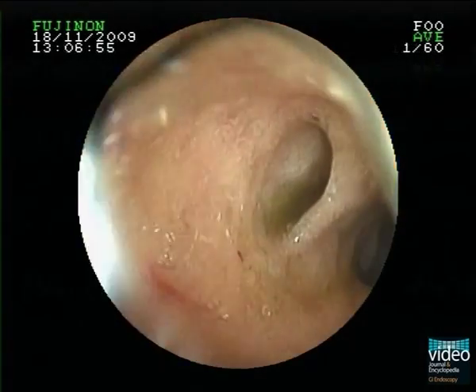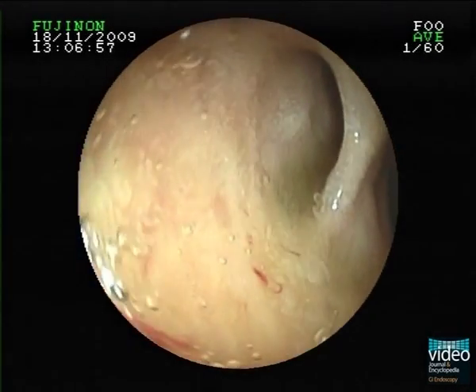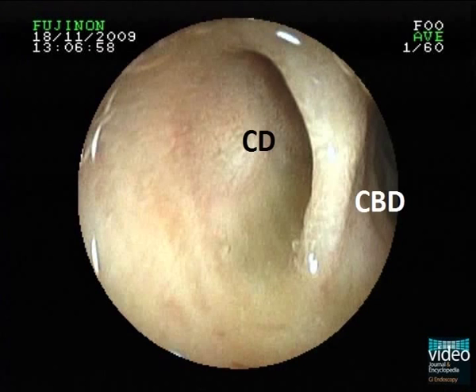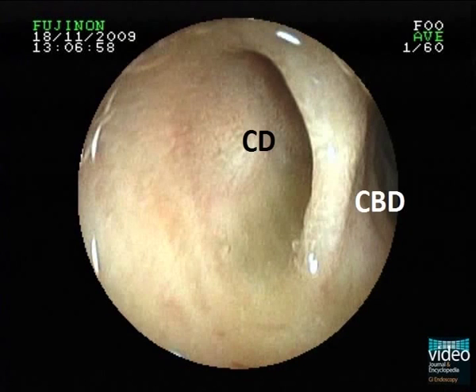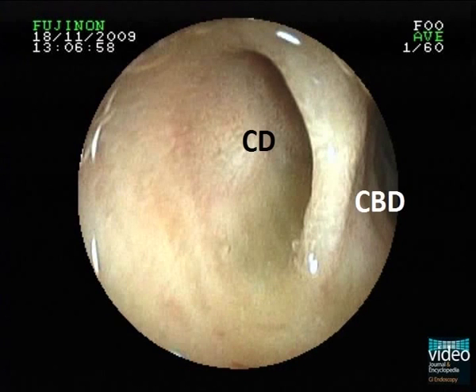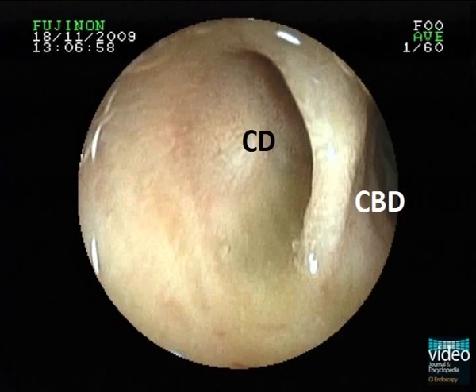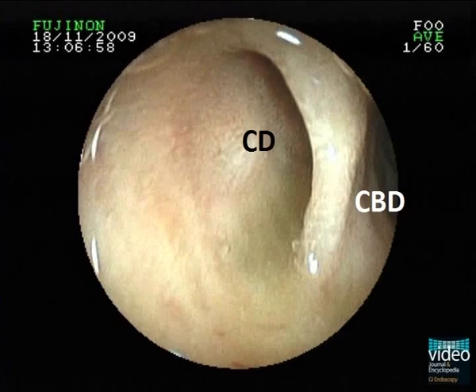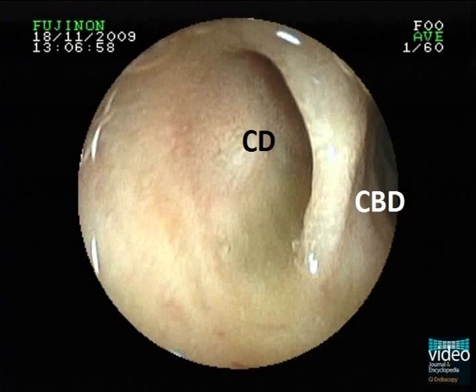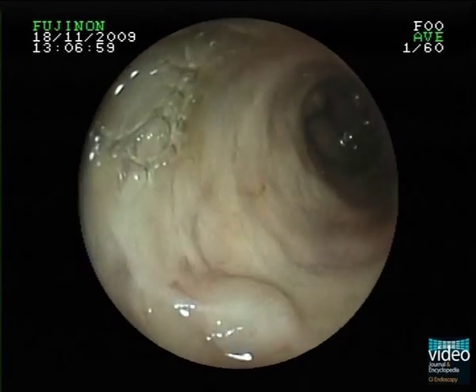Here we perform cholangioscopy with an ultra-slim gastroscope. The endoscope is advanced into the distal common bile duct through the incised papilla, and here we see the cystic duct branching off the common bile duct.